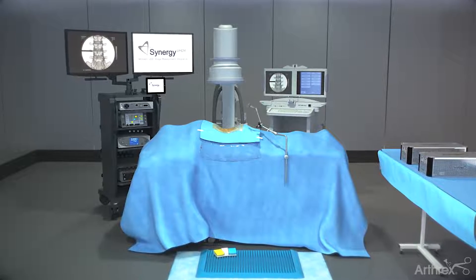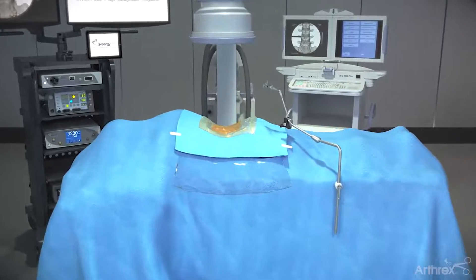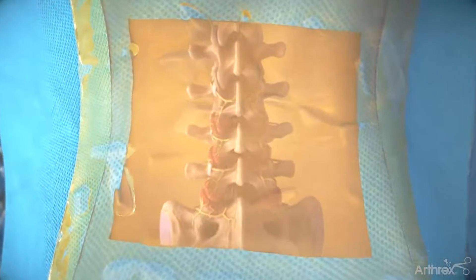The Arthrix Medial Branch Transsection Endoscopic Approach utilizes an endoscope for access and direct visualization of the anatomy. Place the patient in the prone position.